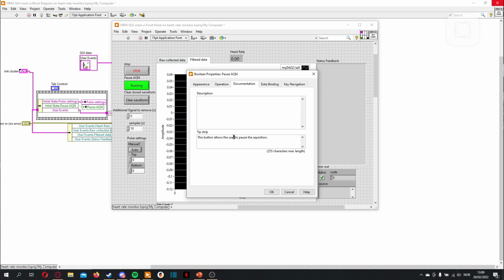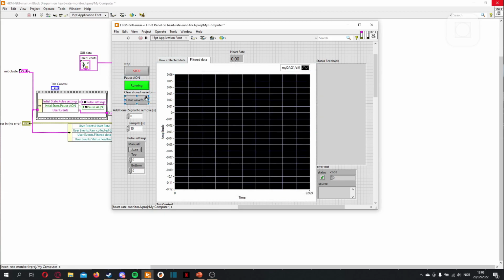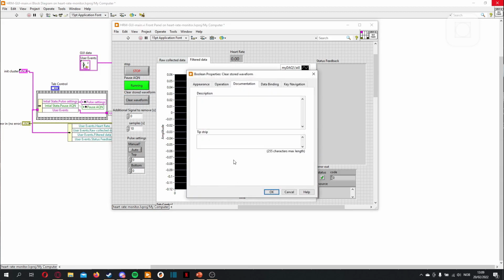Well, you don't have to say user here, you can just say you, or it depends on the type of language you want to use, and then, oh, you don't even have to address the user, you could just write this button, maybe, button clears the waveform. Okay.